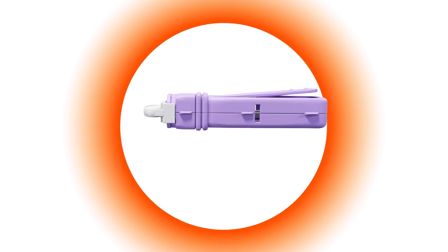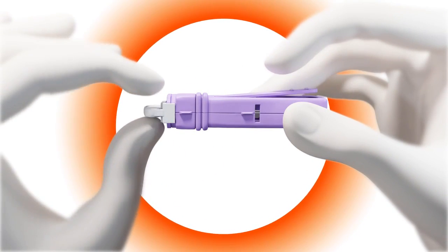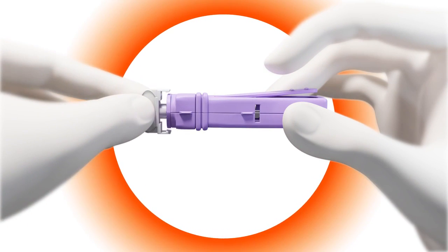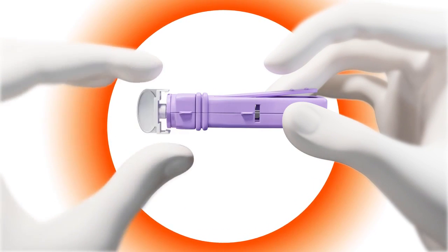Hold the UniStick 3 from the sides and twist the cap a quarter turn to unlock. You will feel the cap advance forward. Do not pull.